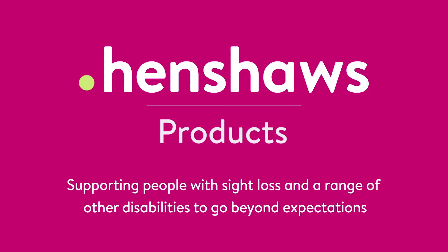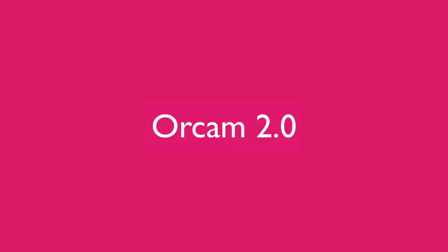Henshaw's products support people with sight loss and a range of other disabilities to go beyond expectations. Welcome to Henshaw's Tips, Tricks and Tech and another video on the amazing OrCam. If you don't know what the OrCam is, it's an OCR device — a reading device primarily for people with sight loss, but people with dyslexia can use it, and also people that understand English but can't read it too well.